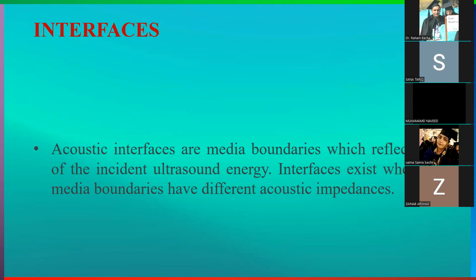So the ultrasound image appears from black to white. So this is in gray shades, right? Can anyone tell me how many gray shades there are from black to white?